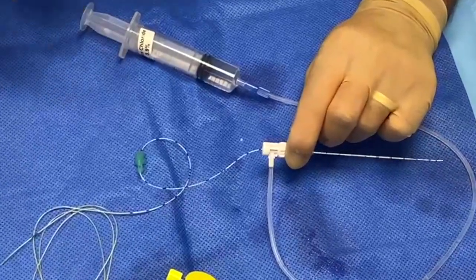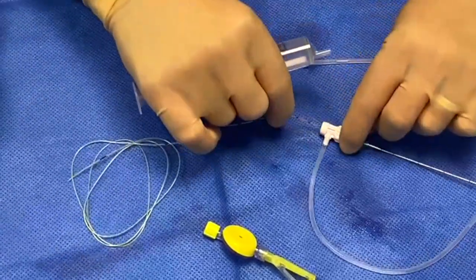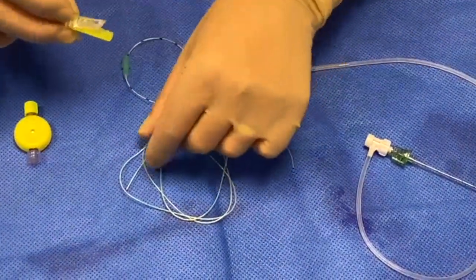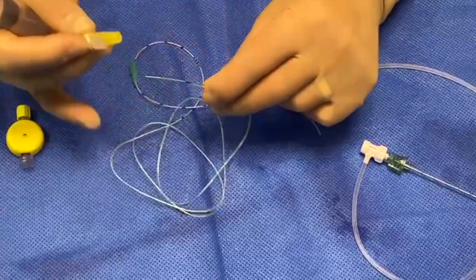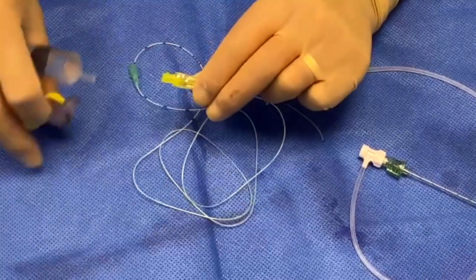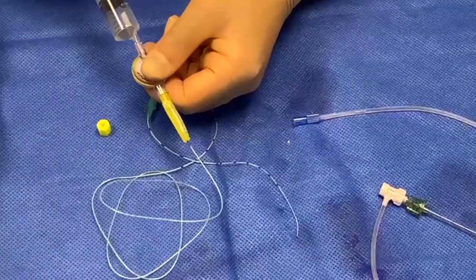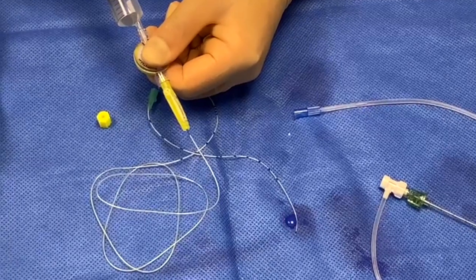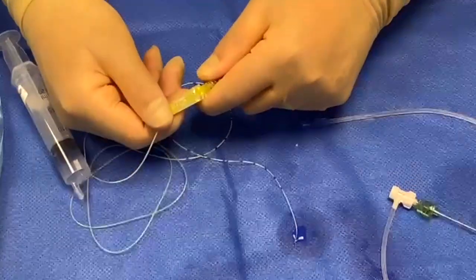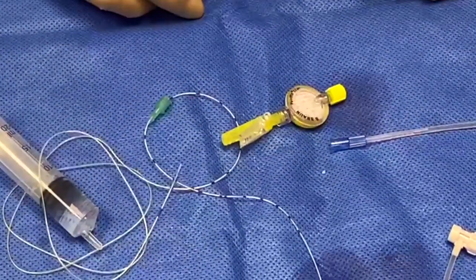The last important point is that in an ideal world, you would test the catheter by flushing it in advance. To do that, attach your clip, pop it up past the black line, attach the filter at the end, and purge it with saline or local anaesthetic to make sure the catheter is actually working and that the holes are patent. To release the clip, simply push down on the tip of the clip and the catheter comes out.